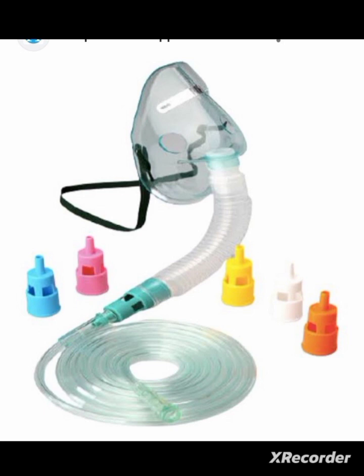This mask can deliver precise high flow rates of oxygen. You can see in this picture, there are lightweight cone shaped devices that can be fitted to the mask, and we can deliver different rates of O2 concentration.